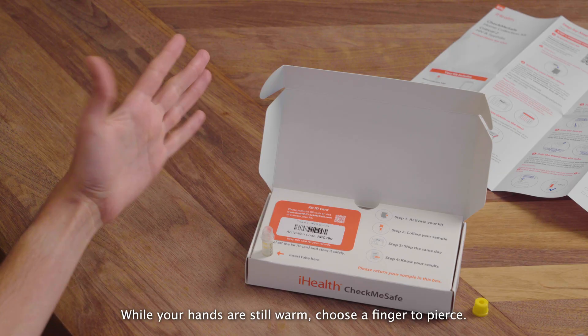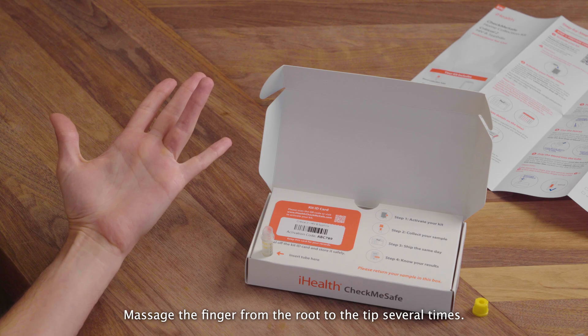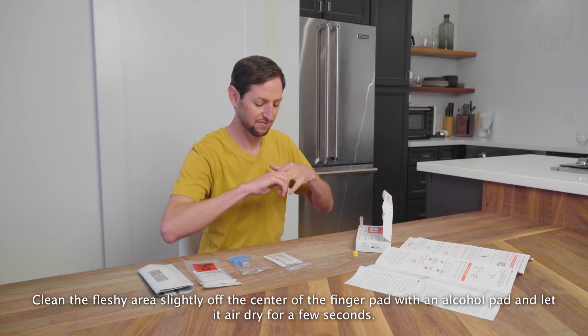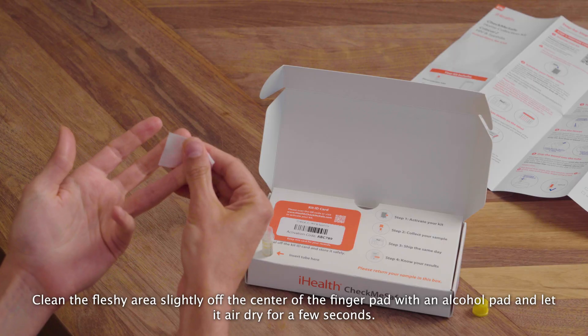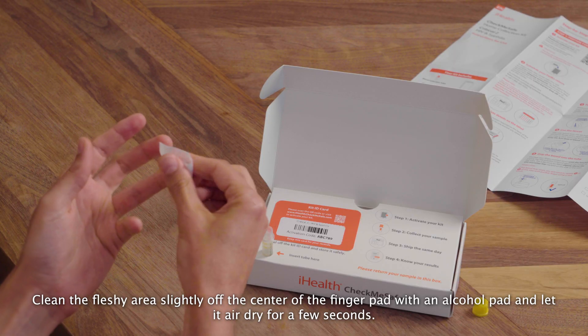While your hands are still warm, choose a finger to pierce. The middle or ring finger of your non-dominant hand is best. Massage the finger from the root to the tip several times. Clean the fleshy area slightly off the center of the finger pad with an alcohol pad, and let it air dry for a few seconds.